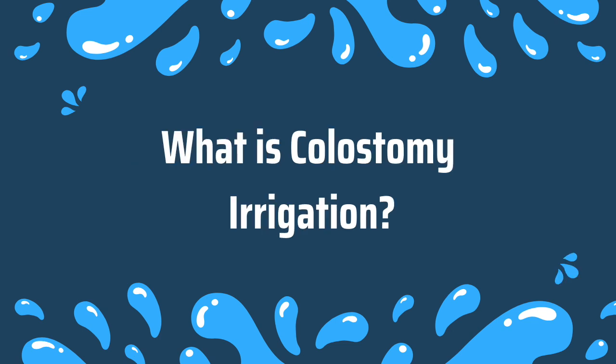What is colostomy irrigation? Well, colostomy irrigation involves the installation of lukewarm tap water into the stoma. And this installation of water stimulates peristalsis, or contractions of the colon, leading to the elimination of their stool, or what's referred to as their return. Colostomy irrigation is a well-established option that's used by some individuals with a descending or sigmoid colostomy to regulate and manage their output.